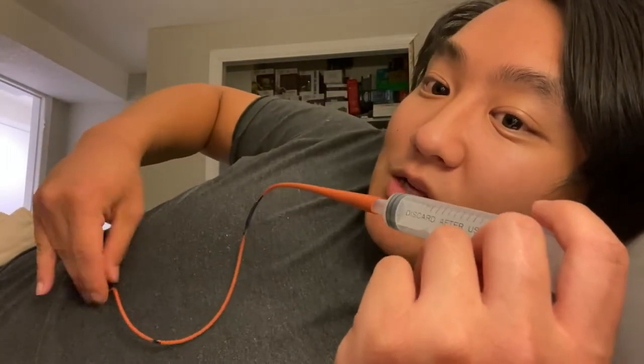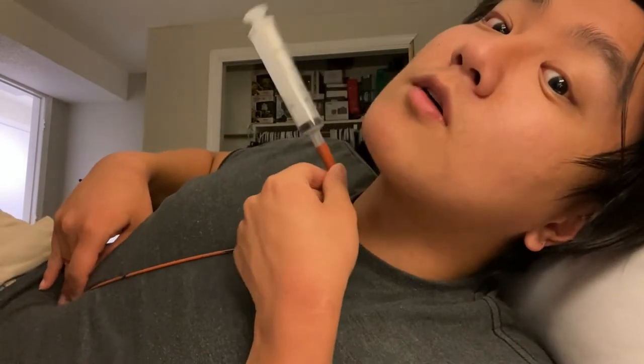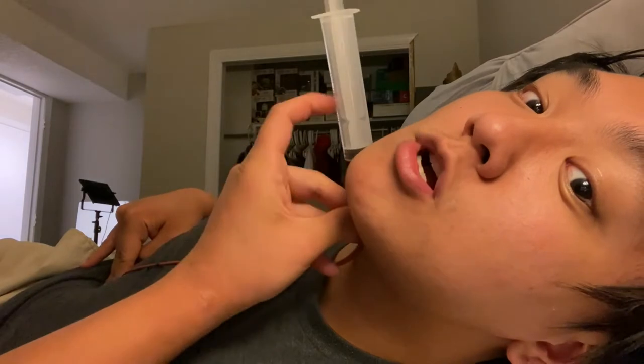From the last rib, keep full contact like this, and then measure from there to the mouth. It should not be arching — it should be flat along the body for accuracy. I recommend measuring from the side. Mark the tube right there where the mouth meets it. You can also pass the black mark slightly when feeding and it should be fine — just don't push too hard and make sure everything goes smoothly.